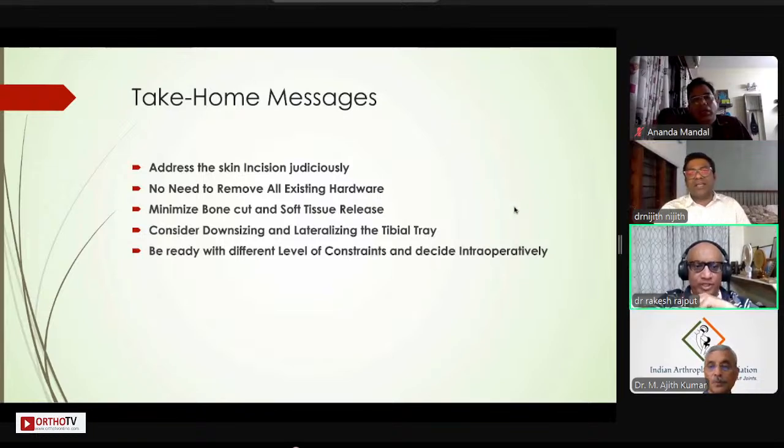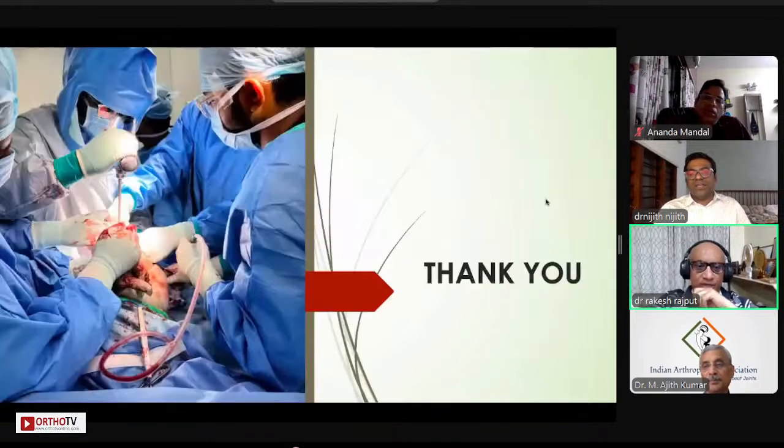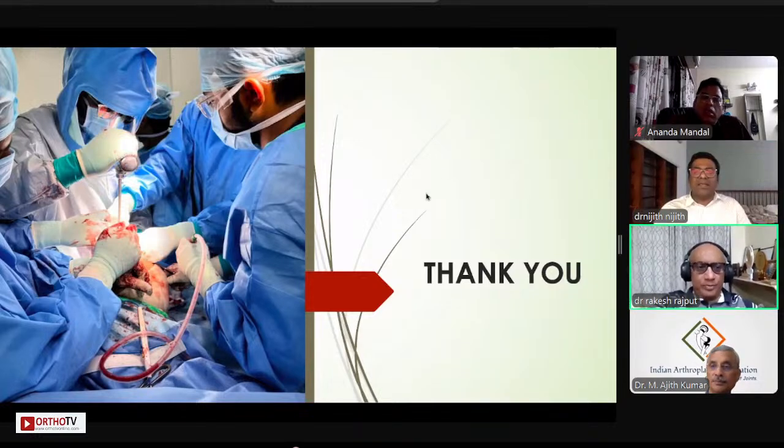There's a question on the chat box. Why did you have to use the stem? There was a defect in the tibia, sir. I managed with cement and screws, and there was a proximal tibia fracture also, I feel.